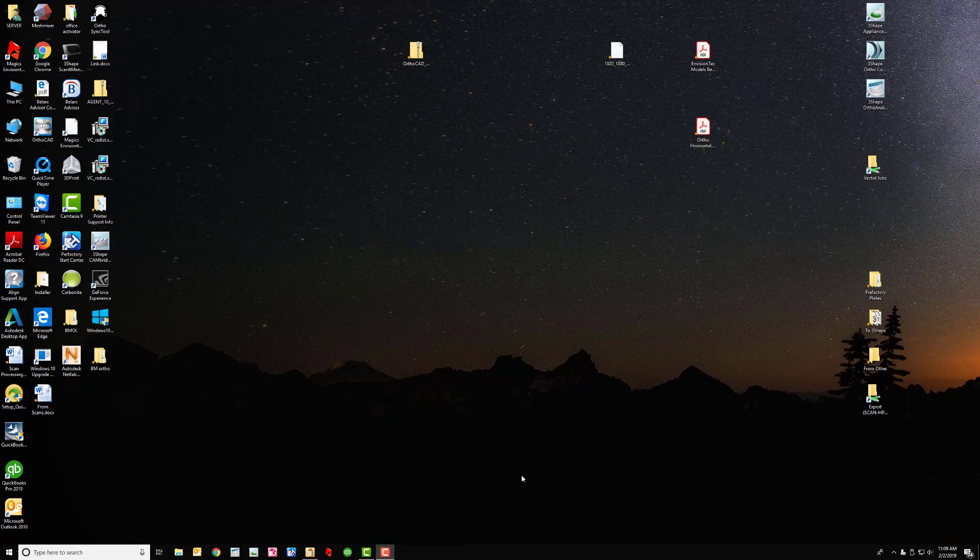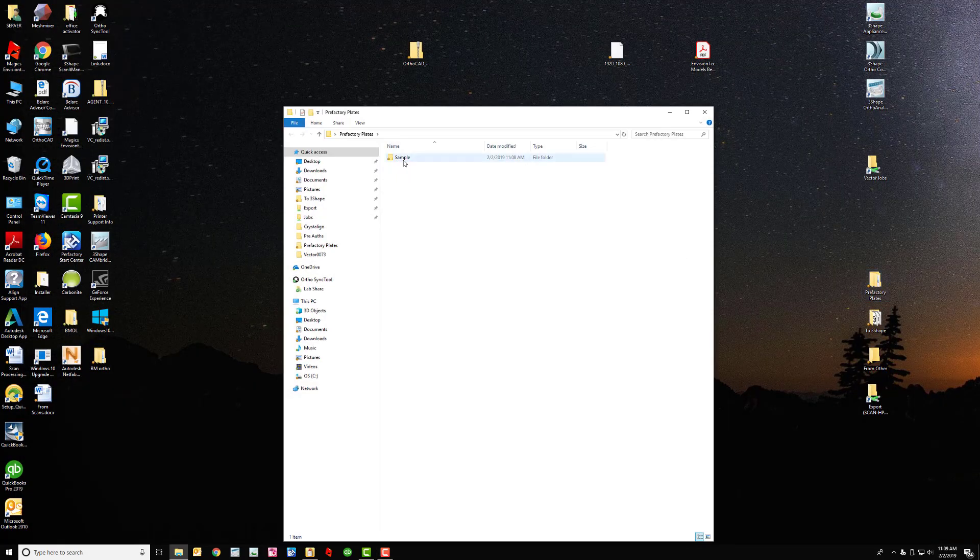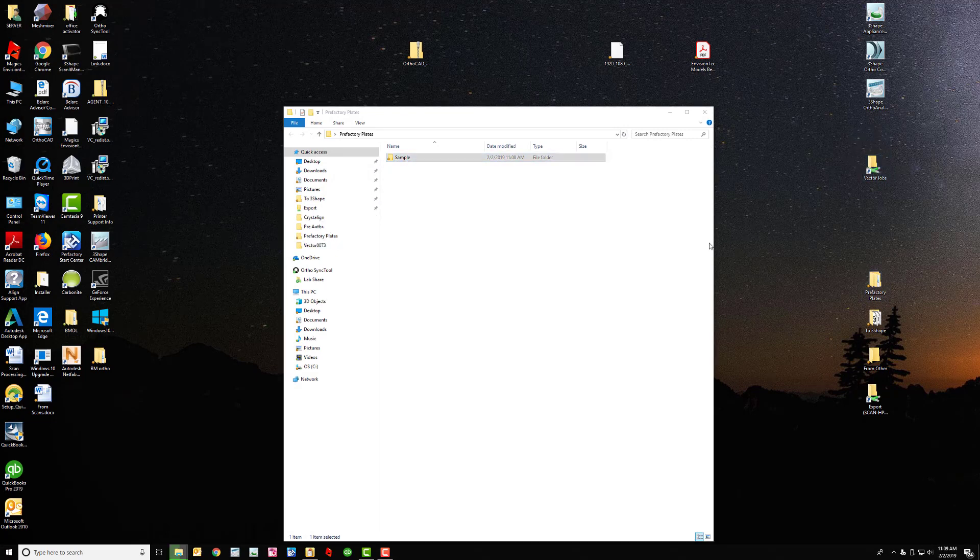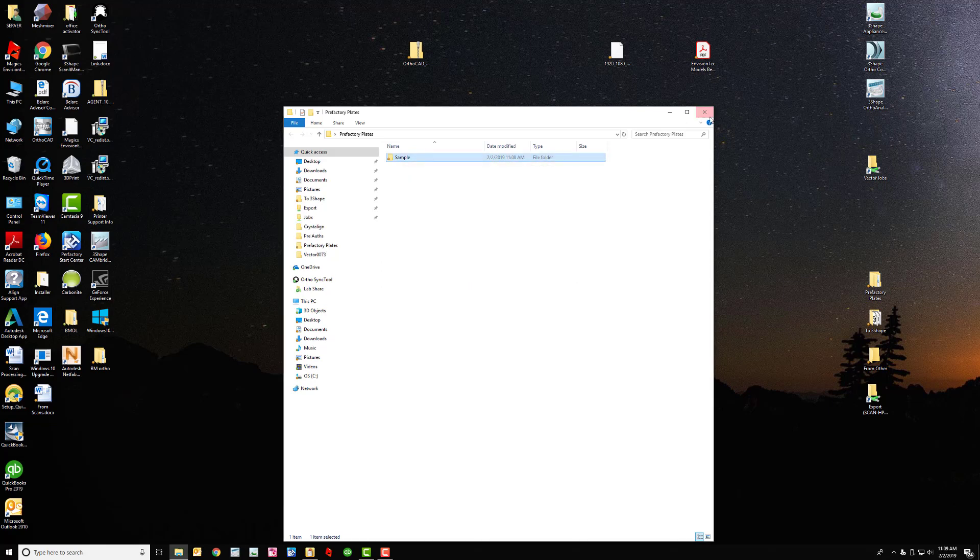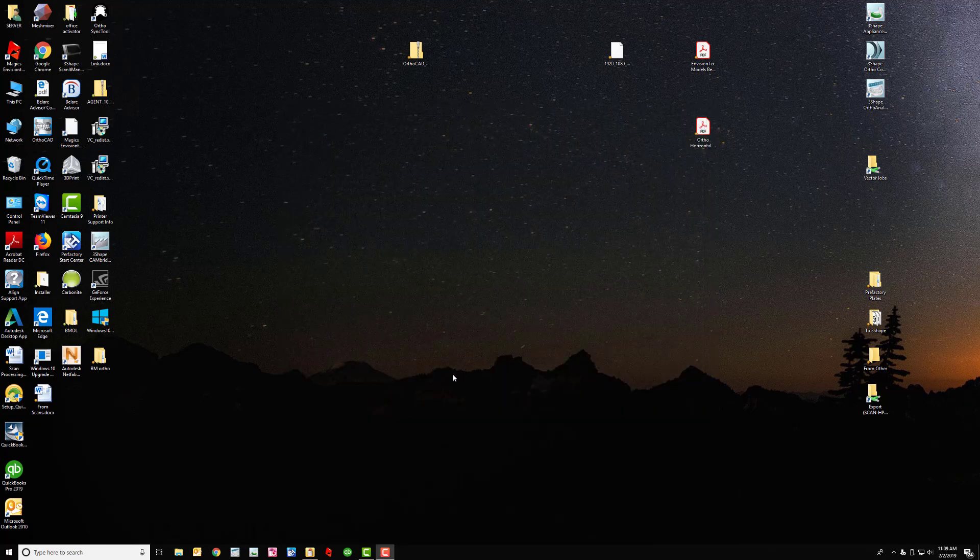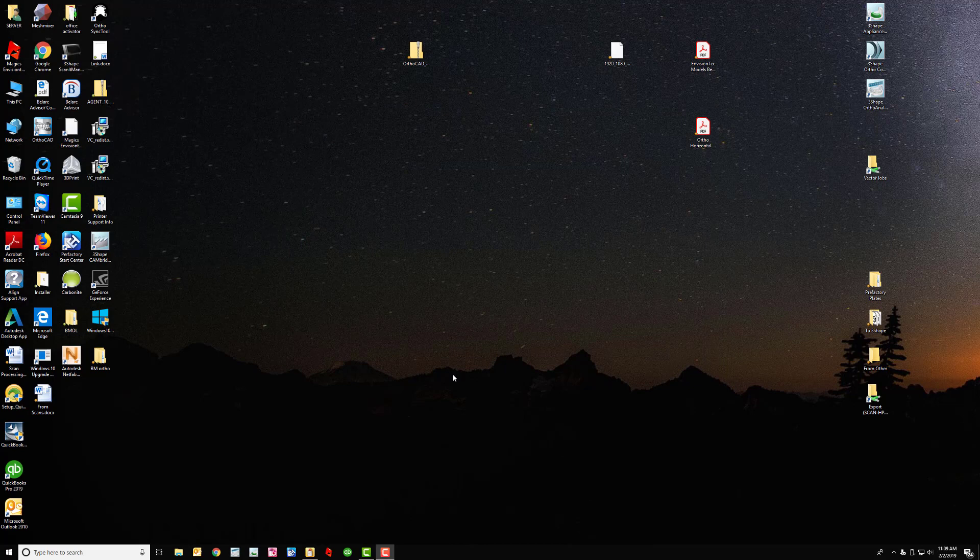So I can come into my prefactory plates, drag the sample or drag the file over into vector jobs. And then that's it. I can go over to the printer now, load the job, start to print, and it's going to print. So that's my workflow.